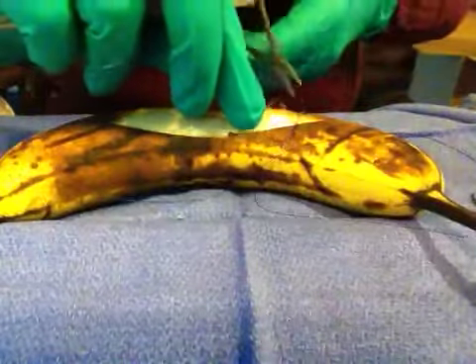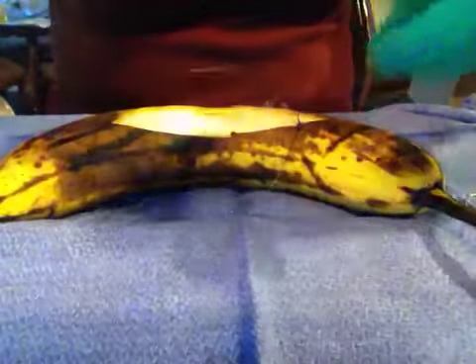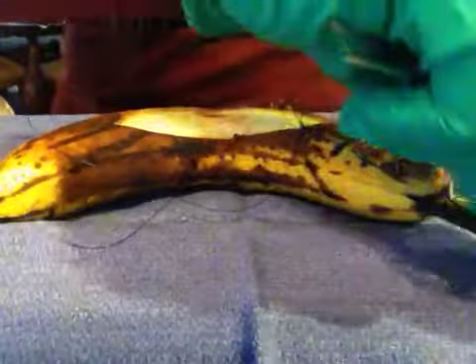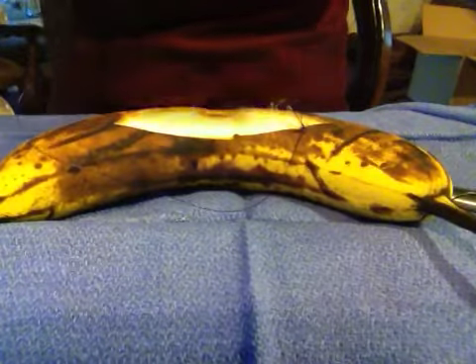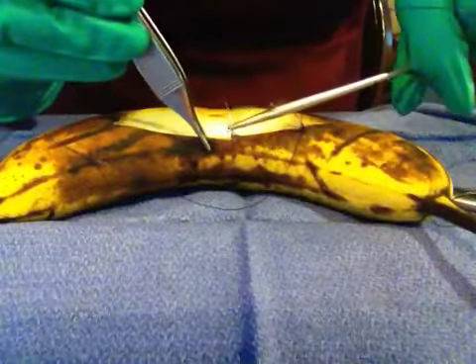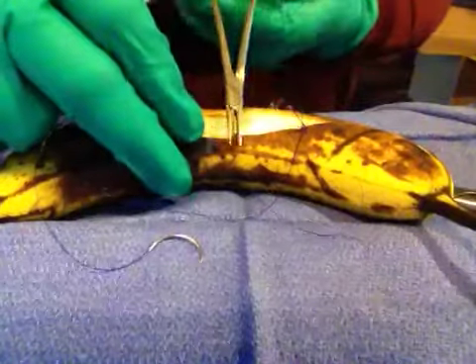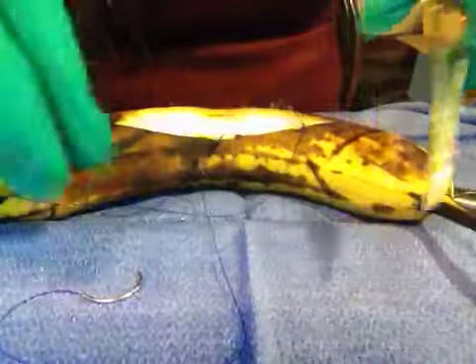I'm going to put a suture on this side and leave it kind of long. I have this suture, I'm going to put a suture on right here. My banana has a big nice hole in its belly, and I'm going to cover it — I'm going to stuff it with gauze.